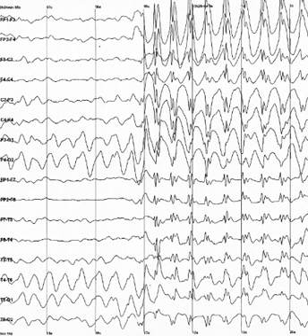Simultaneous EEG recordings and fMRI scans have been obtained successfully, though successful simultaneous recording requires that several technical difficulties be overcome, such as the presence of ballistocardiographic artifact, MRI pulse artifact, and the induction of electrical currents in EEG wires that move within the strong magnetic fields of the MRI. While challenging, these have been successfully overcome in a number of studies.